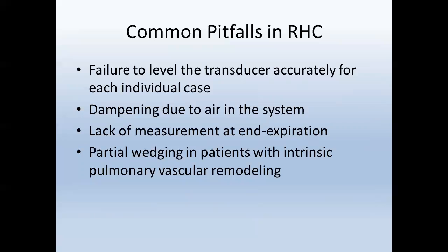We were all excited, like, oh my God, this guy has to be a responder. Then we went and looked, and it was just dampened, because we didn't flush the catheter, there was a clot in there. So you just have to think of these things. If you're seeing a huge, significant response, it's like, oh, what's wrong? Let me make sure things are okay.